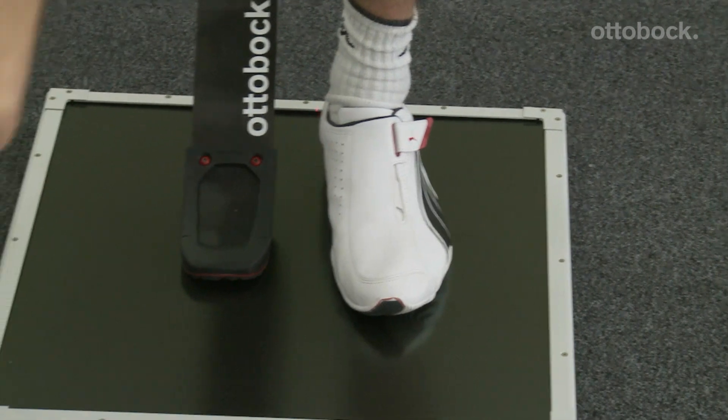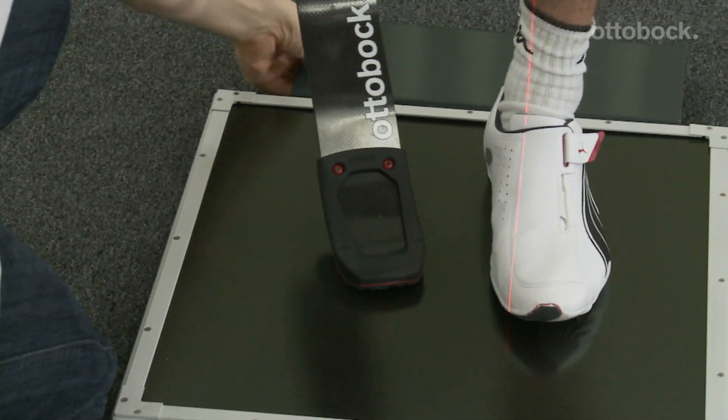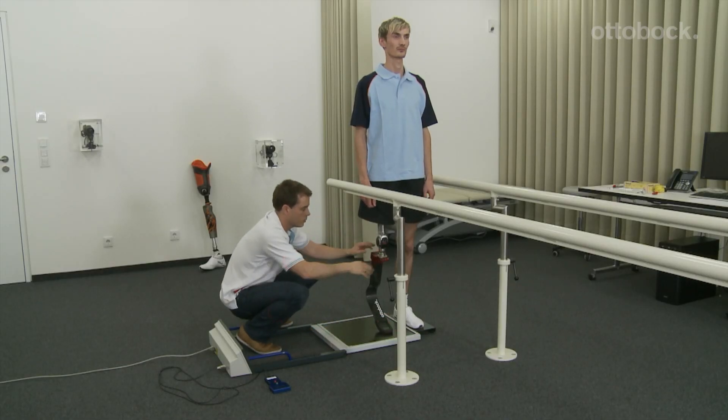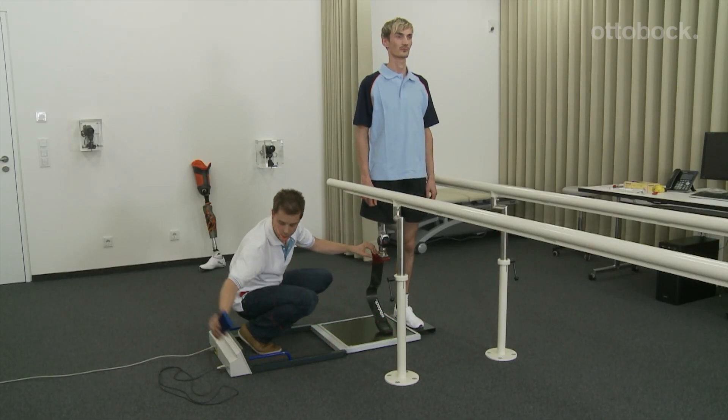The sagittal plane is now checked. Note that the reverse displacement of the knee axis is greater than 80 millimeters for beginners and is 80 millimeters for advanced users.